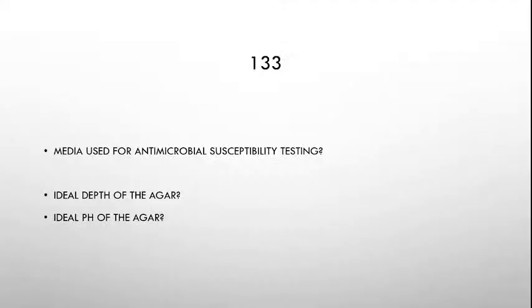I really appreciate it. Now, there is what you call an ideal depth. There are the ideals of susceptibility testing. I know, it's so stupid. But we really need to remember it. Would you believe it? I worked in a CAP accredited hospital before, and one of the things they look for in our documentation is the depth of the agar, of the control agar. It's silly to remember, but it is one of the documentations we need to do when we create our own culture media.